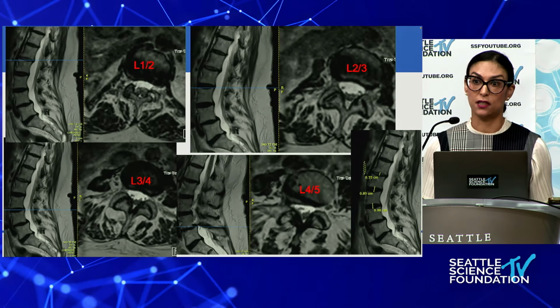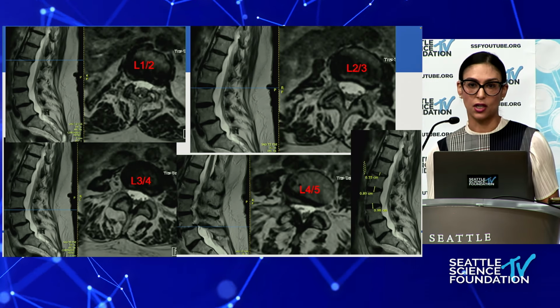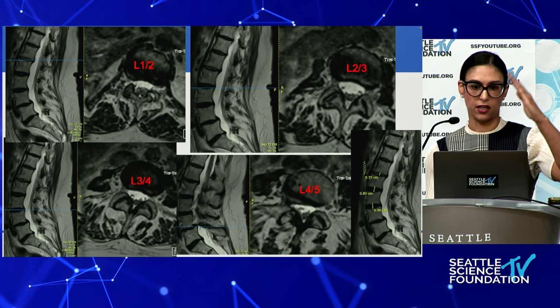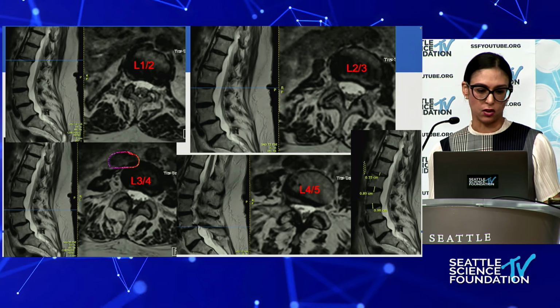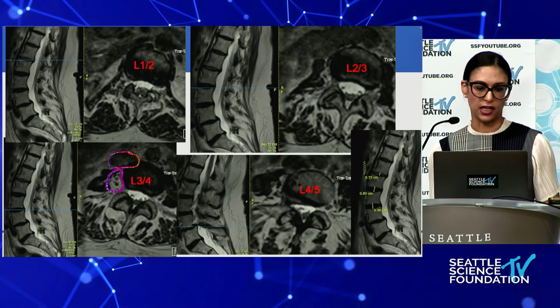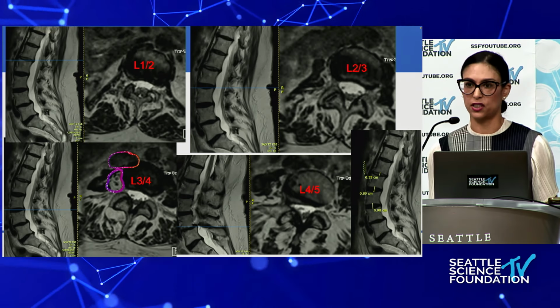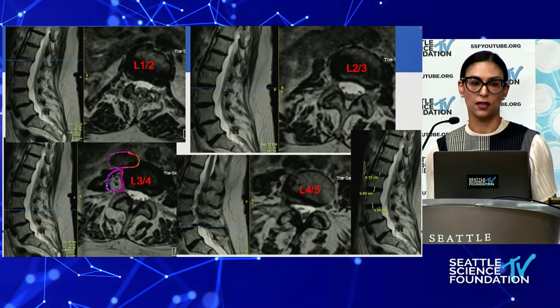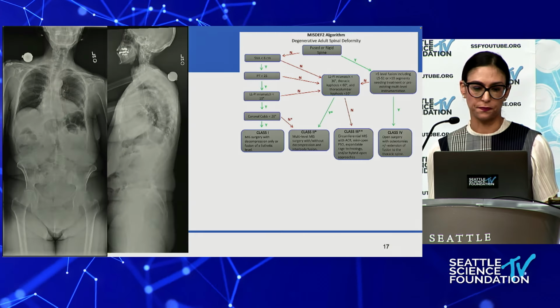And then the question is, what side are you going to go for? We've touched on this a little bit before. Although her concavity was on the right, and in terms of accessing, that's obviously the kind of radial arc that you'd like to go from, when I looked at it, she had this dorsal vessel there, and also the plexus covered the entire vertebral body. So I didn't feel like it had a great corridor there in terms of getting to the L3-4 specifically. So in that case, I decided to go on the left.